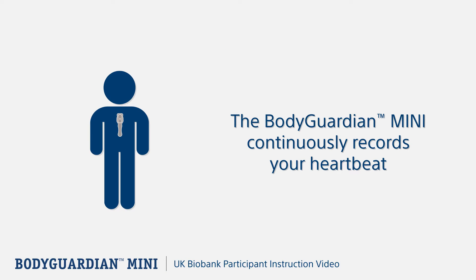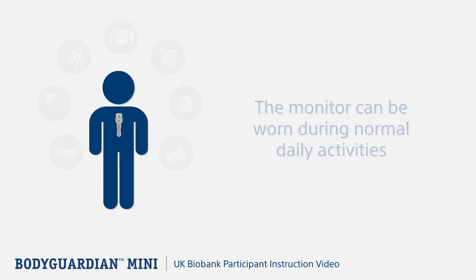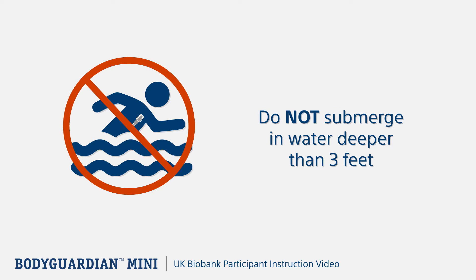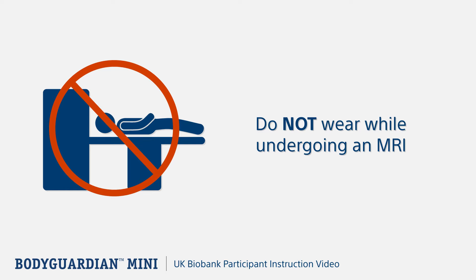The Bodyguardian Mini is a heart monitor that continuously records every single heartbeat while you live your life. It can and should be worn during all normal daily activities, including showering, sleeping, bathing, and during exercise. However, it should not be submerged in water deeper than 3 feet and cannot be worn while undergoing an MRI.